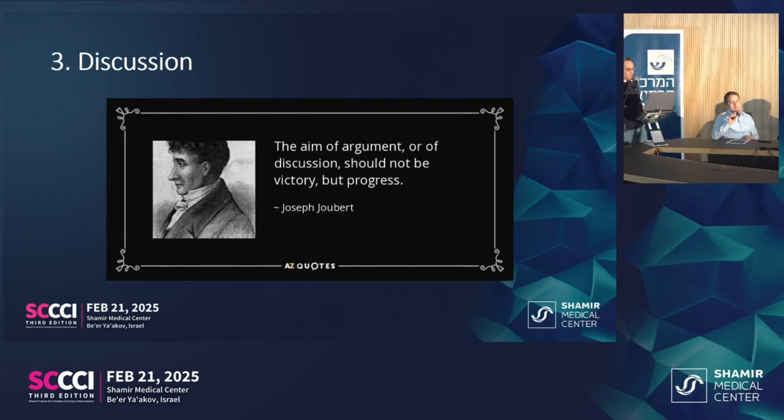One point that I've learned in cases from our center is that when you mess around with the TAVRs in the ascending aorta, make sure there's no significant trauma. We do a CT in these cases, because you can create a dissection or a hematoma. And then I'll get back to you to ask what do you think was the mechanism of the dislodgement?